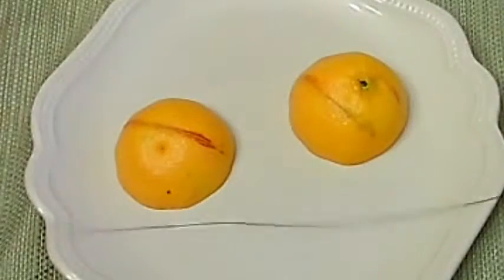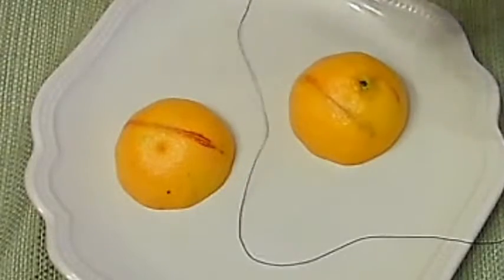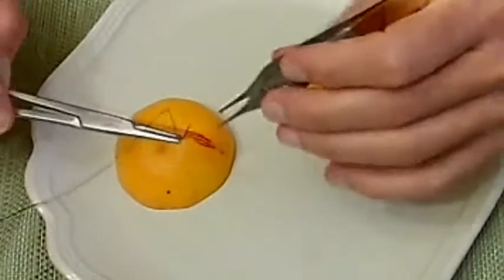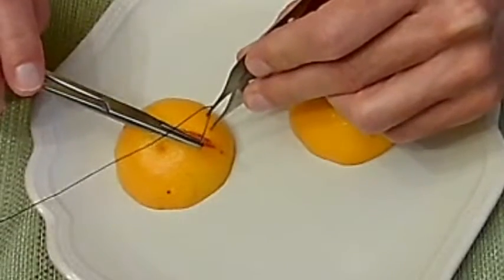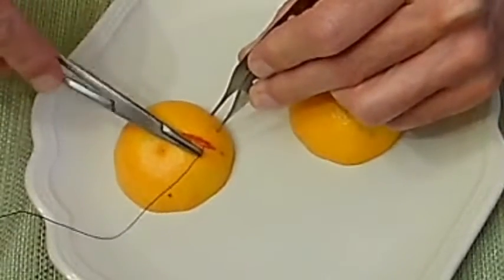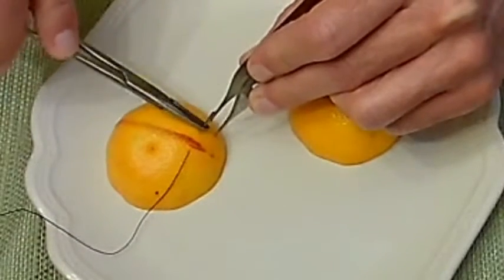In the last video on suturing, I used a light suture, so I'm just going to repeat the last part that you couldn't see. This is a 2-0 silk, a heavy suture. The first one is going to be a horizontal mattress, and this time you'll be able to see where the suture is.